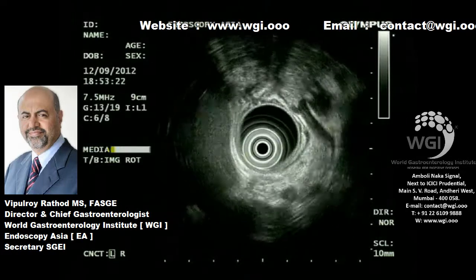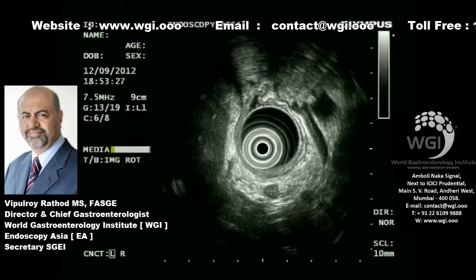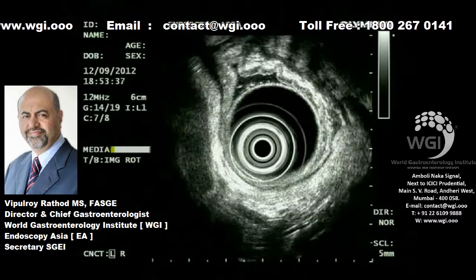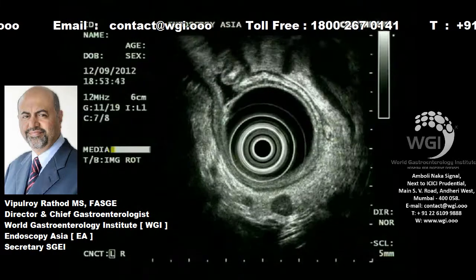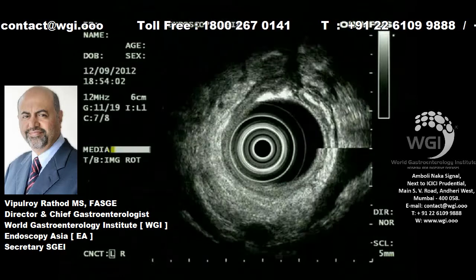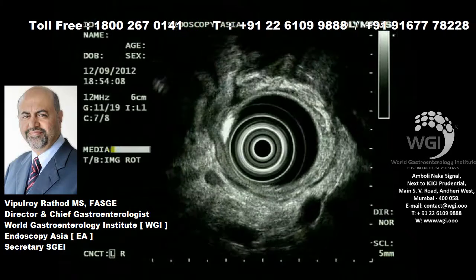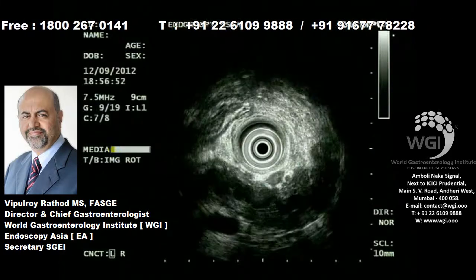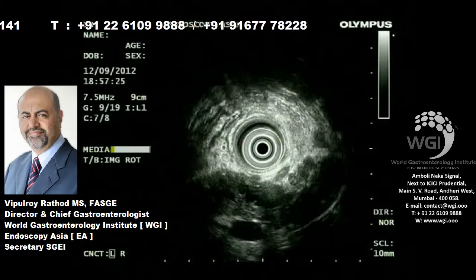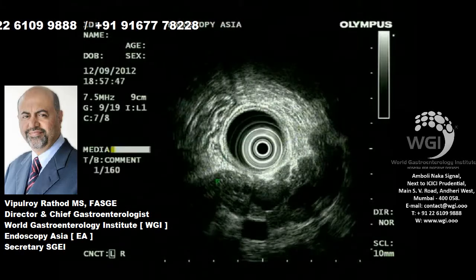We are looking for lymph nodes, and yes, we see small, tiny hypoechoic nodes in the celiac axis region. Now, it's important to magnify the image and see these are round hypoechoic sub-centimeter, 7 millimeter nodes in the celiac axis region with a large tumor in the head of the pancreas, dilated bile duct, dilated pancreatic duct, and careful observation of dilated pancreatic duct would probably also show some mural nodules occasionally.